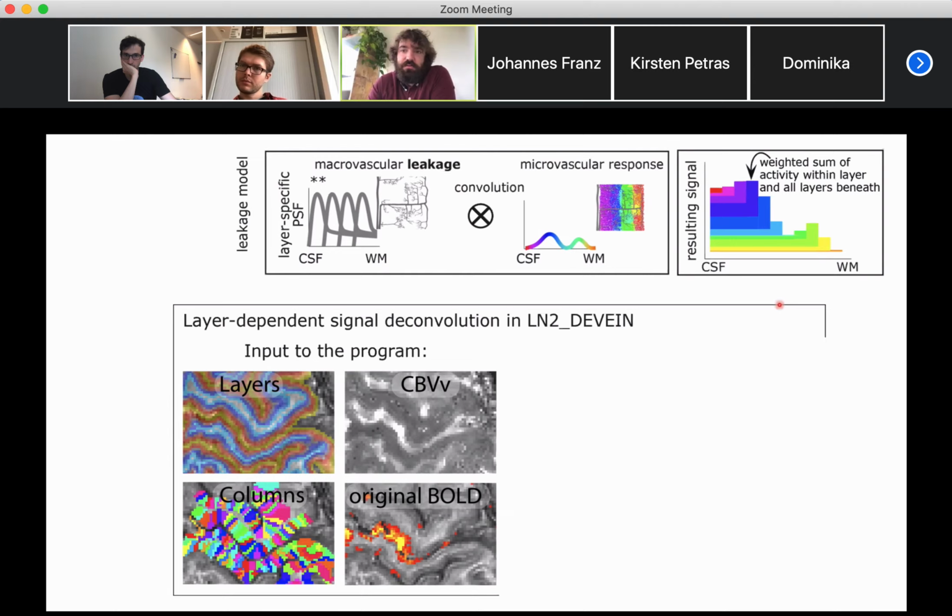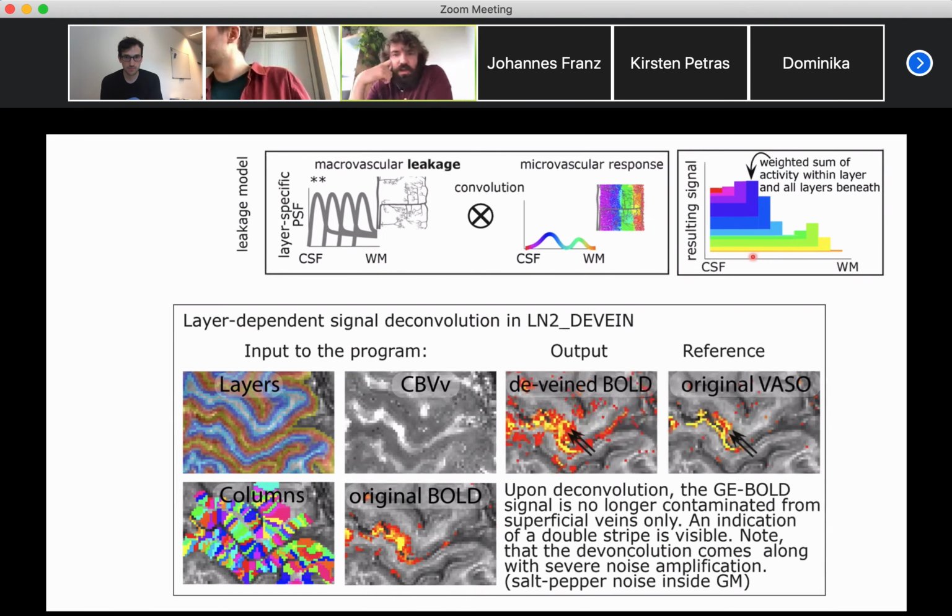So you see something that looks very similar to a linear scaling model, but the physiology underneath it is much more complicated. Despite this complication, LayNii requires no other information than what we've already made for the previous model, and attempts to deconvolve this effect over space. Again, naively, this looks like the scaling model that we looked at previously, and I kept Renzo's text in here because, again, the noise is an important detail here.